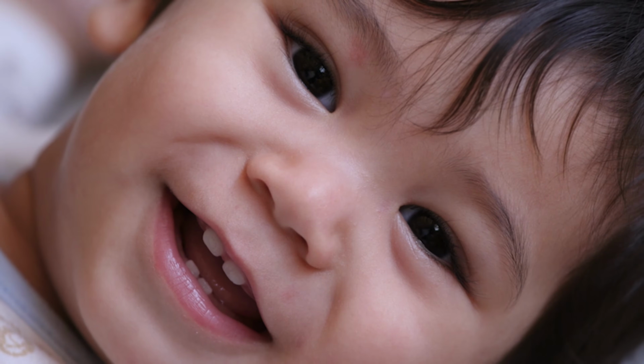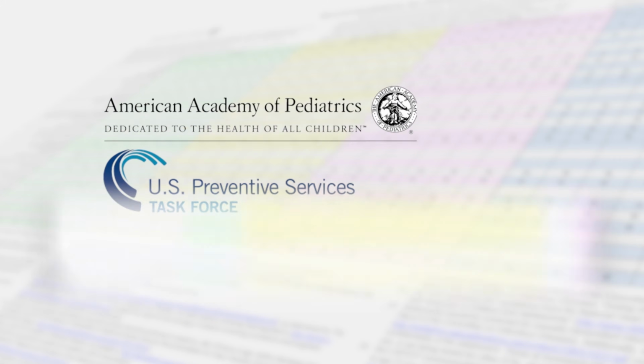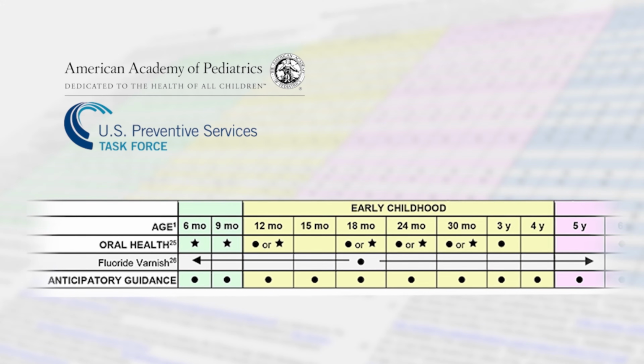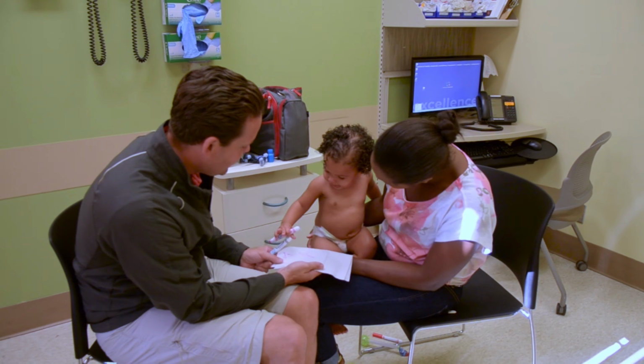Fluoride varnish is an easy, safe, and effective way to protect children's teeth from dental caries. The American Academy of Pediatrics and the United States Preventive Services Task Force now recommend fluoride varnish applications every 3 to 6 months for all children ages 6 months to 5 years as a part of a well-child visit. The whole process takes less than a minute.